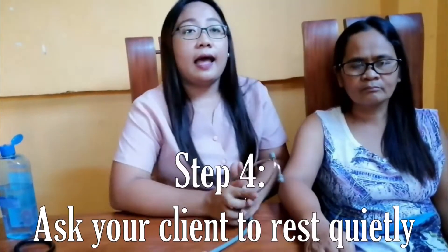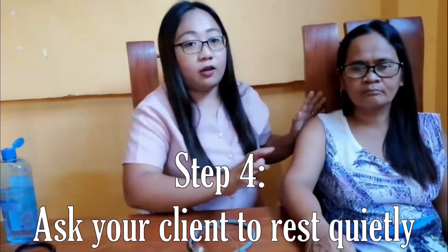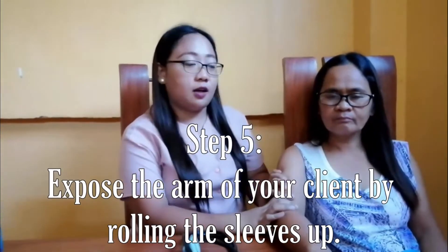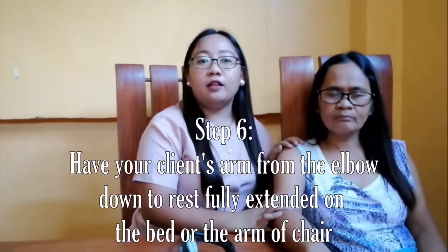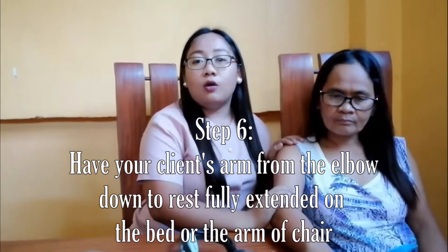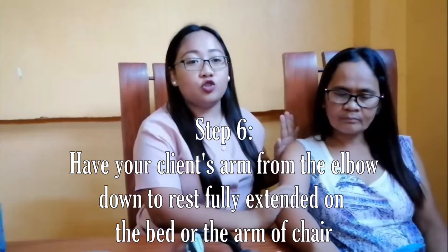Number four: ask your client to rest quietly. Next, expose the arm of your client by rolling the sleeve up. Have your client's arm from the elbow down fully extended on the bed or the arm of the chair.